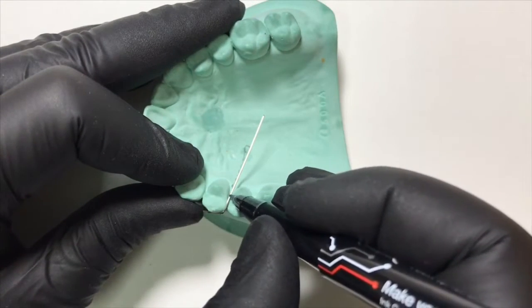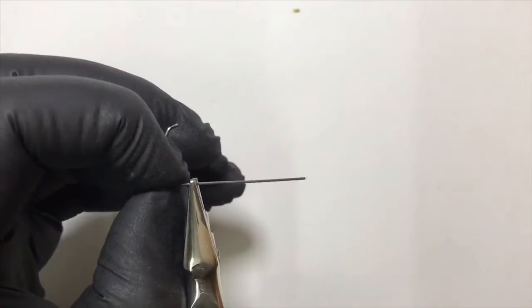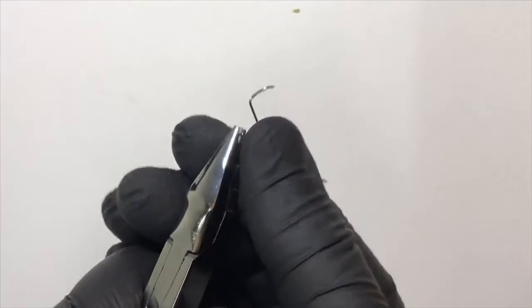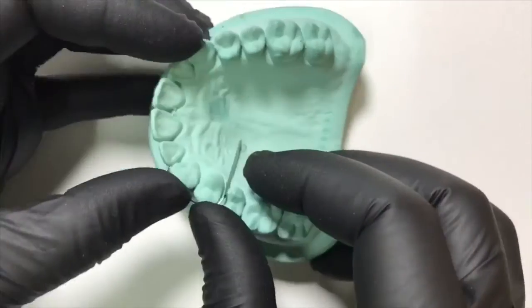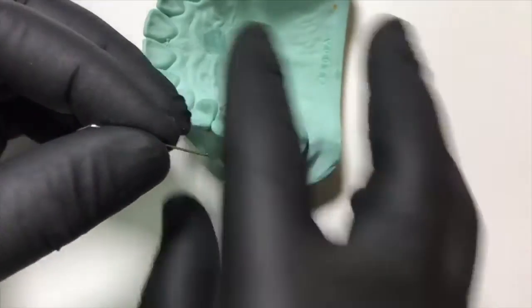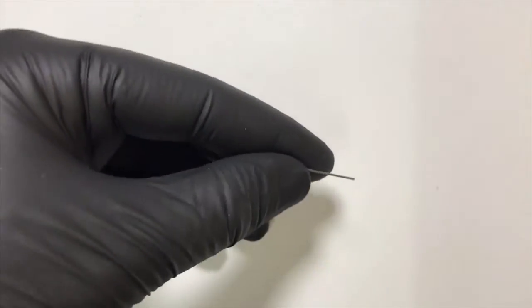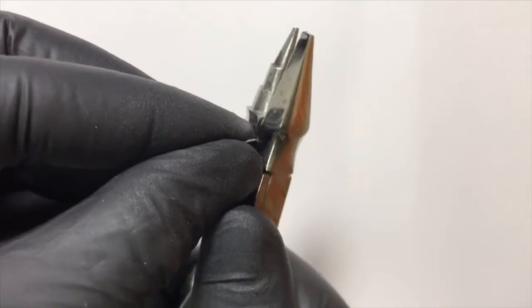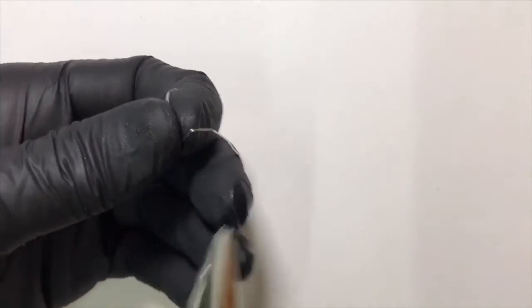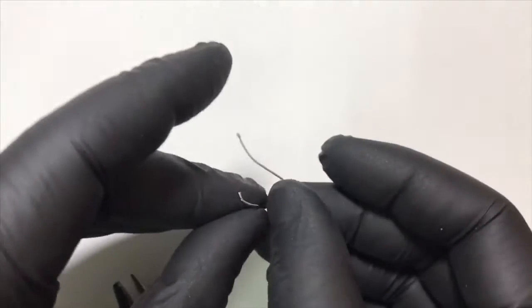We give a marking for the palatal adaptation, which will help in engaging the palatal aspect of the canine retractor. Using the beak of the plier we give another sharp bend, then cut the extra wire of the retentive arm. We engage the end of the retentive arm in the beak of the plier and form the tag portion, making slight adjustments to follow the contour of the palate.